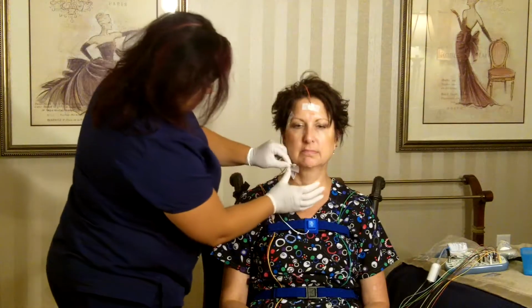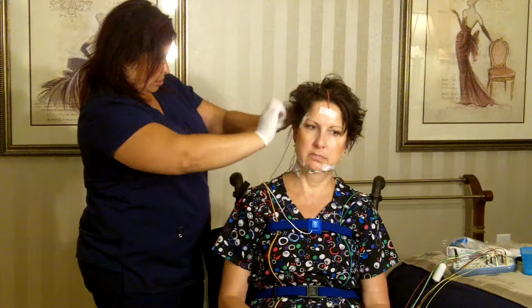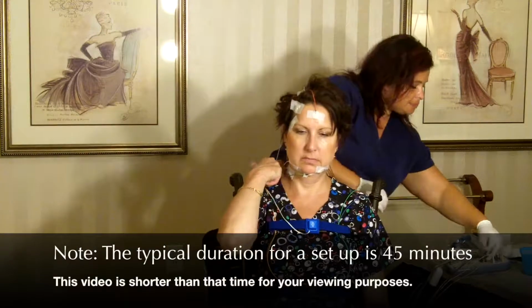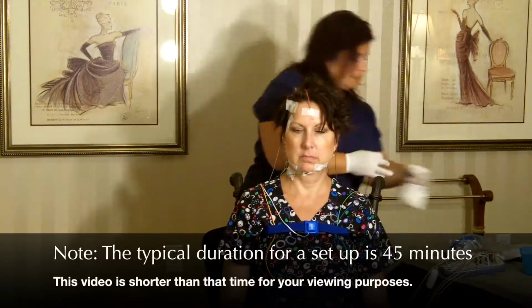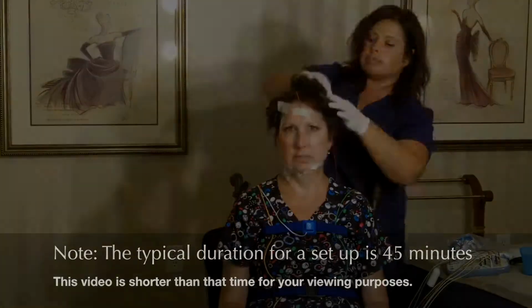Wires are then placed on Kayla's jaw to measure if she is clenching or grinding her teeth. These sensors can also measure when Kayla is experiencing REM sleep. REM stands for rapid eye movement and is also known as dream sleep. Mindy will now place 6 wires on different spots on Kayla's head. And one final electrode to measure eye movement and REM sleep.